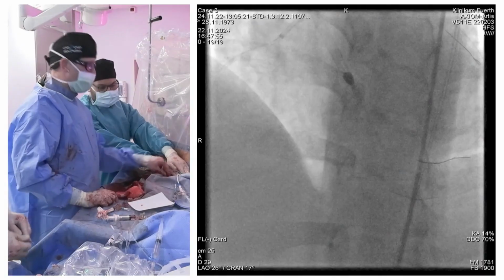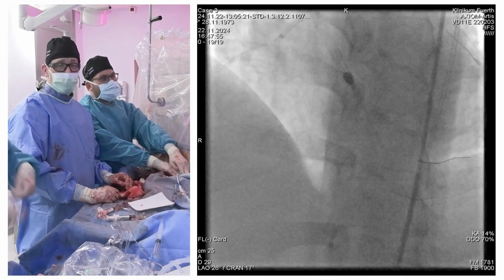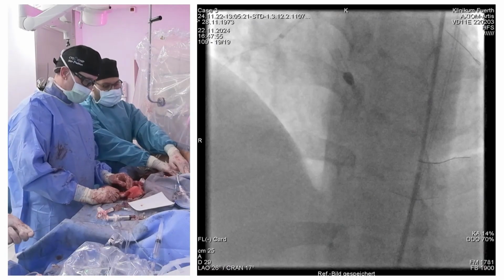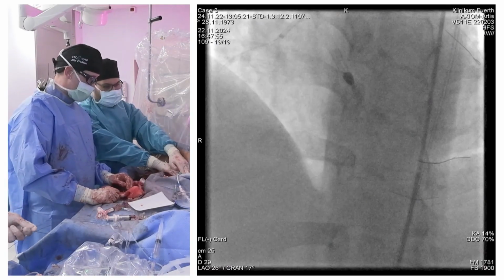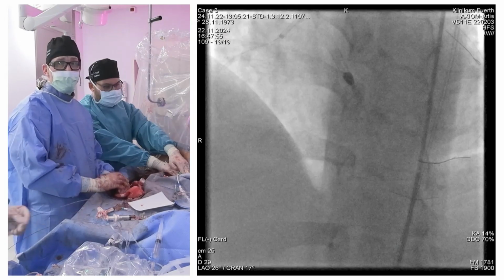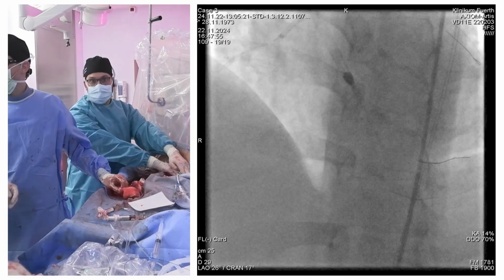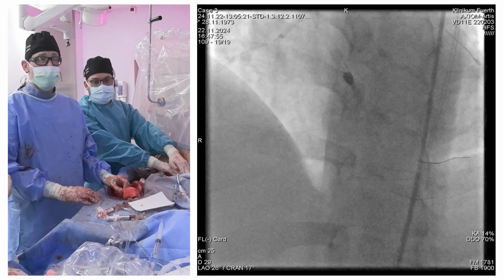And then you can blow up the balloon with whatever pressure and the 5.0 without any fear that you're going to rupture. So I think we accompany you during the last steps of your procedure.